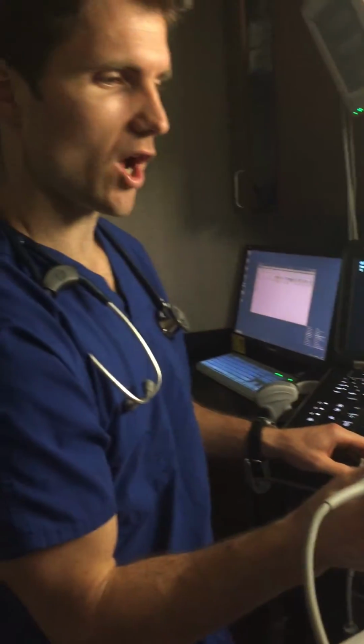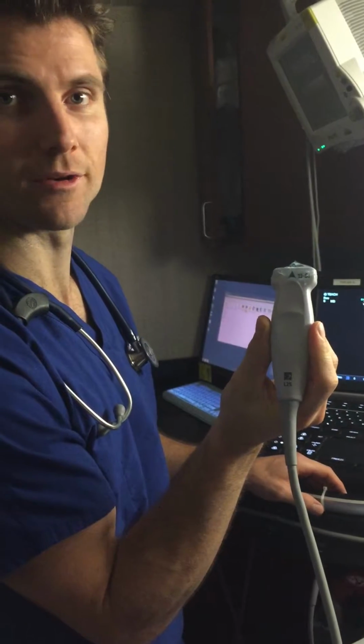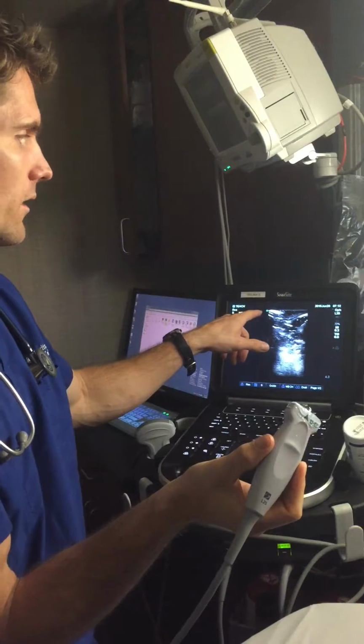Today we're going to demonstrate the ocular exam. Typically you use the linear probe. It's got great resolution and short depth. And so the indicator you can see is here, correlates to the blue dot there.